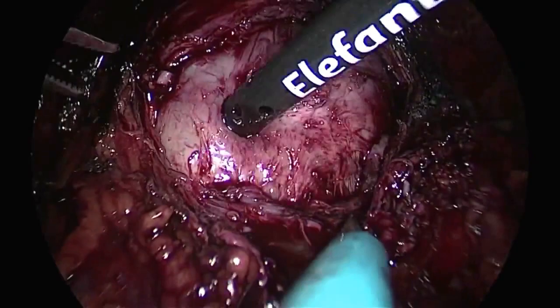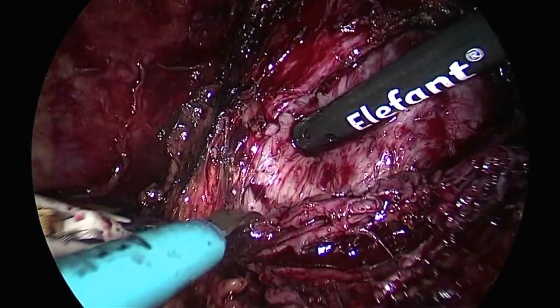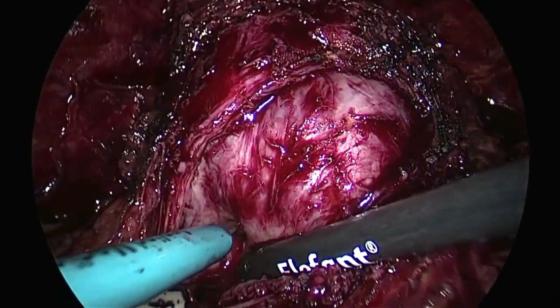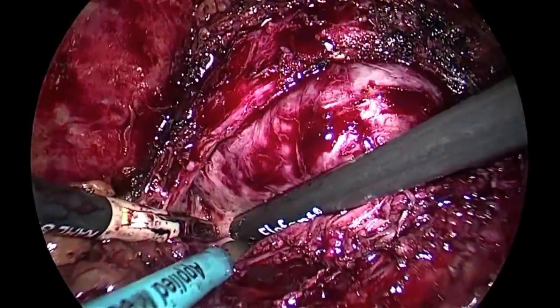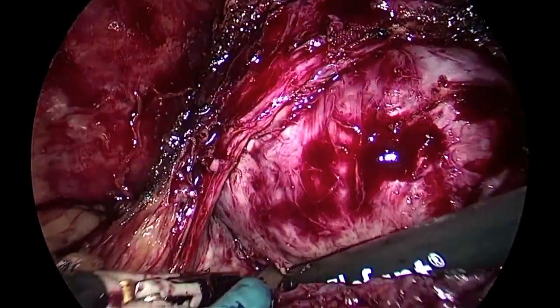Well, what is the advantage of this technique compared with the classic Millin? I think there is no difference in comparison with the standard Millin. This is a typical approach. I duplicate it. It's the same. The only difference is that I don't use the special divaricator, as you know, that was used in open surgery. In this case, my dissection is performed exactly as you can see, with my instrument.